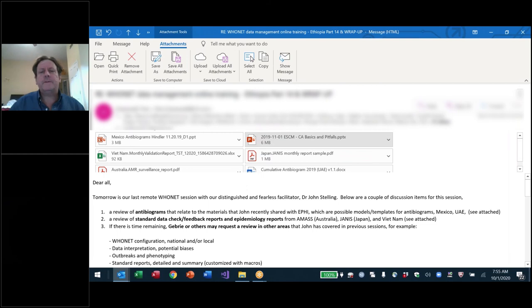So one kind of surveillance that I recommend is just collect the routine data. If you can, use it for epidemiology and treatment guidelines and other things. If you can't, use it for data collection. You use it for data quality improvement and feedback. Use the patient data that are routinely available.